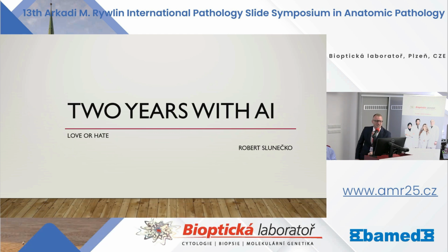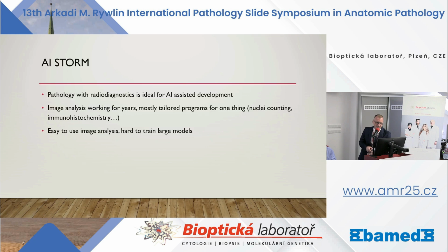So thank you very much. I'm working as a pathologist here in Bioptická around 16 years or something like that, and I specialize in urologic pathology and mainly prostate and urothelial carcinoma. 2 years ago, we started working with AI, and since then AI is everywhere.